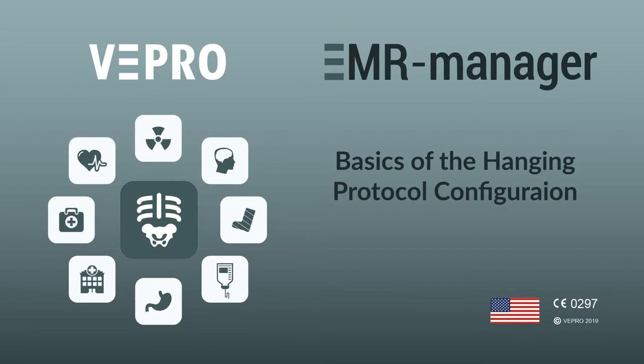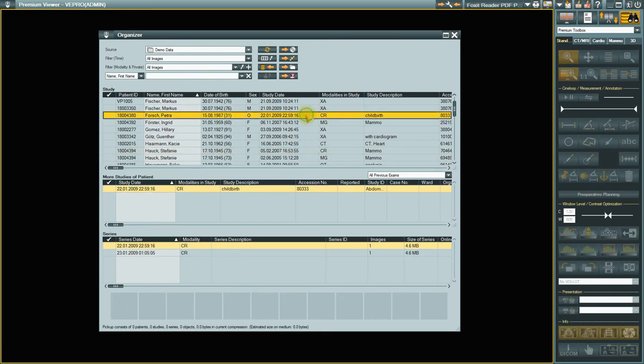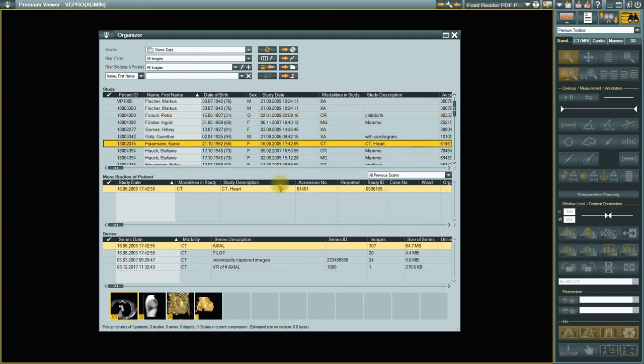Basics of the Hanging Protocol Configuration. First of all, I'd like to give you a brief overview of how to configure a hanging protocol. This achieves uniform presentation of specific image series and studies by means of configurable parameters.